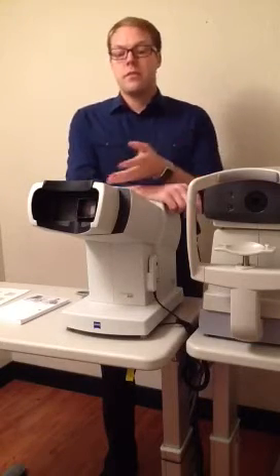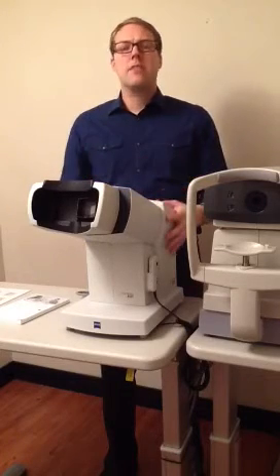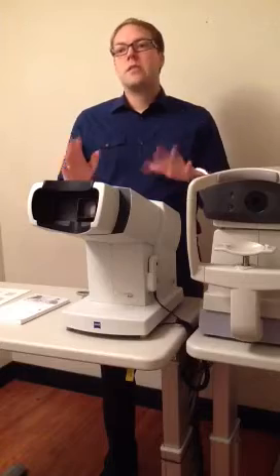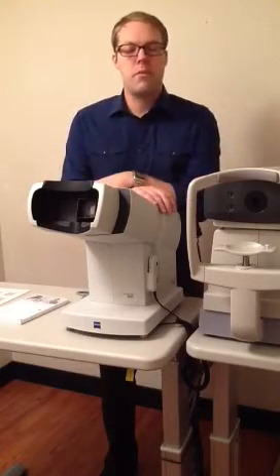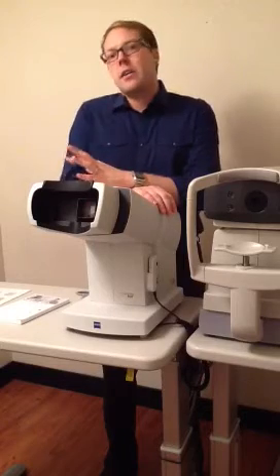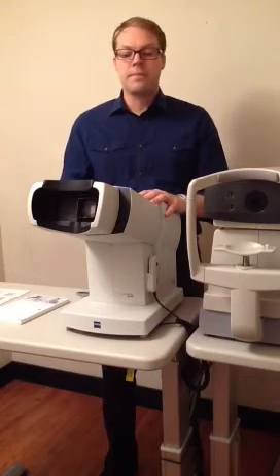So this is the visual field test. Dr. Thompson wants you to have this done today, and then go on to tell them what it does. It checks for lots of different ocular diseases and disorders. And when you do this, you can say that in any way that's comfortable for you. Lots of eye problems, ocular issues, diseases, whatever feels good for you. But tell them what it does in a general sense. This checks for lots of different eye problems.